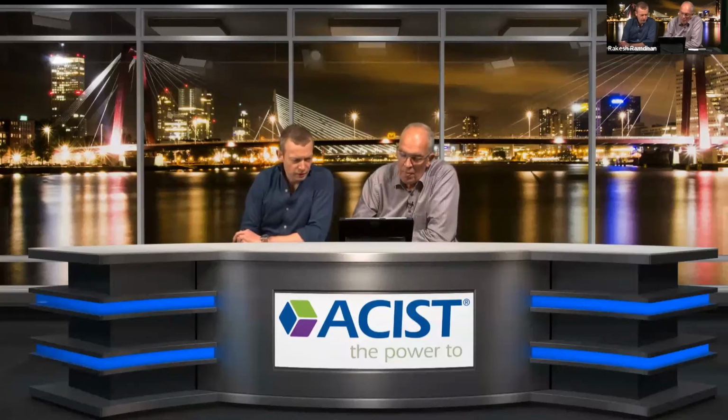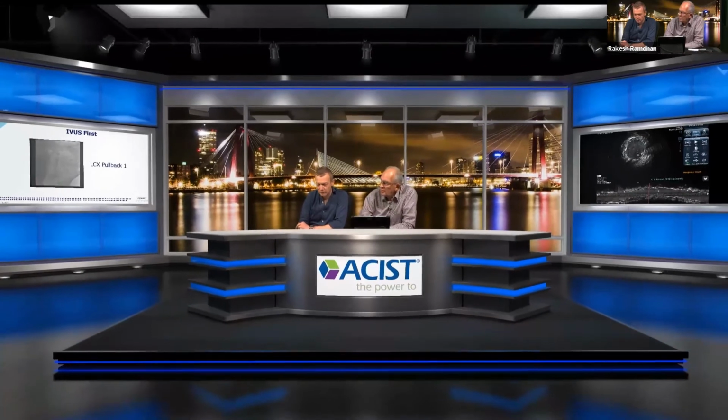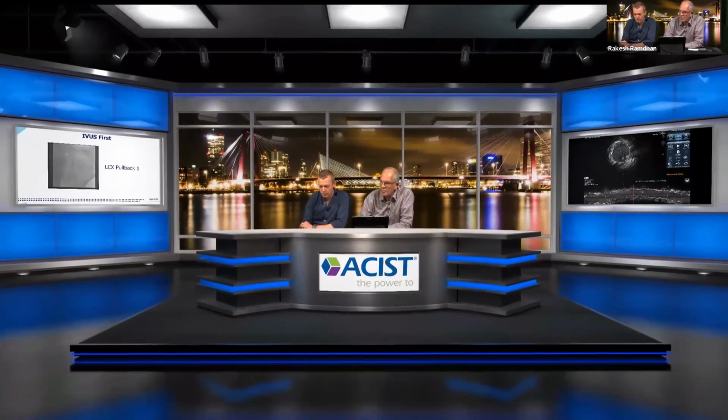So maybe Jurgen can demonstrate that to you in the next case when we'll do the pre-PCI and the sizing algorithm. In brief, the key trick is to put a lumen marker distally in a healthy reference segment, mark that as reference, and then you go to your site of minimal lumen area, which you can identify by eyeballing quite accurately, we've recently discovered, and you get your percentage area stenosis.